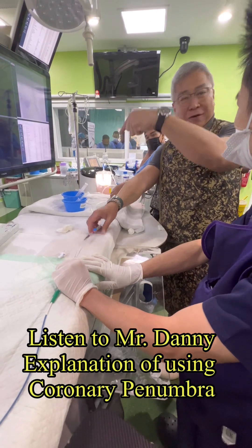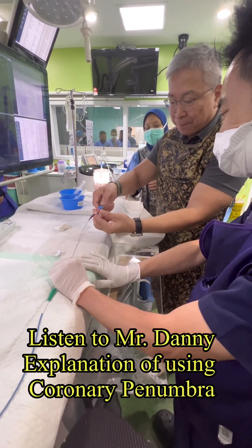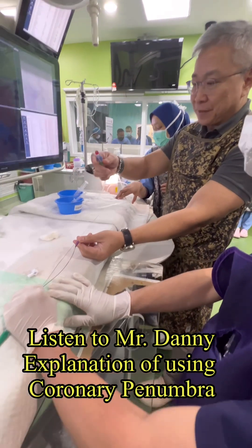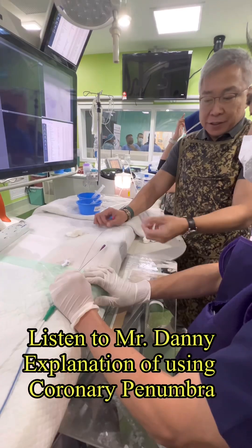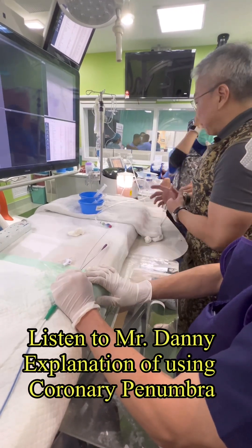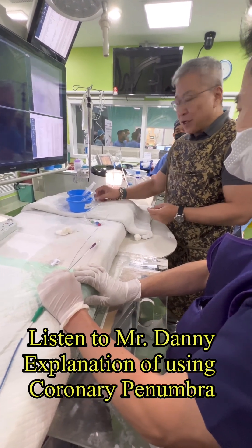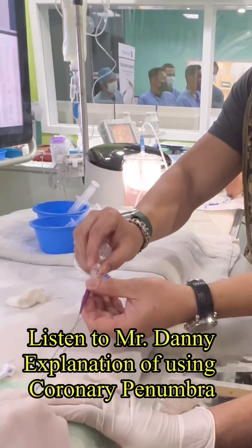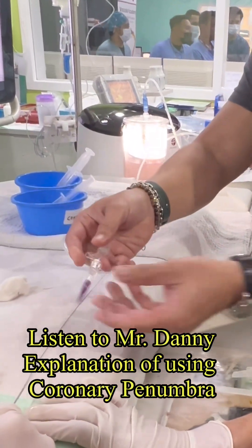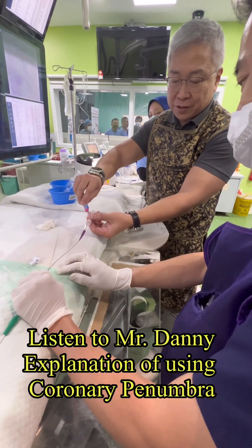You push it to whatever position that you want to go to. The tubing — you either do a direct connection, but we do have a separator. In case you need a separator, you have to use a Y connector that comes with the system. How you connect the Y connector? You connect to this CATRX, and then the tubing you connect to the sideboard.